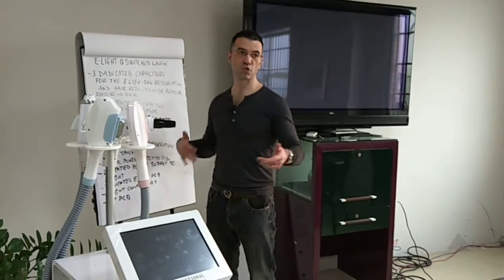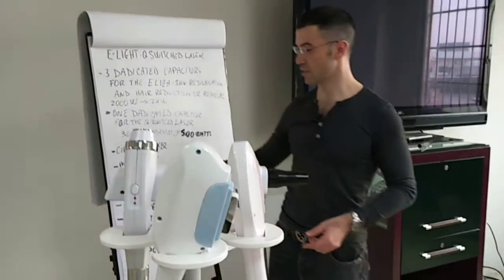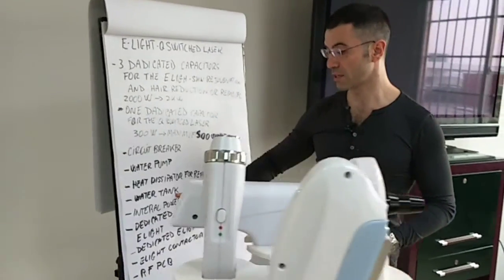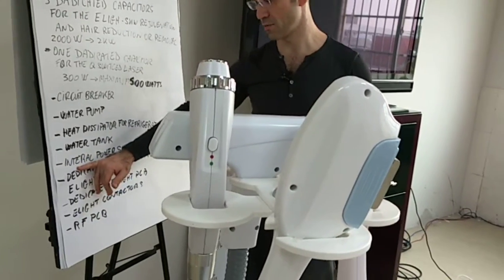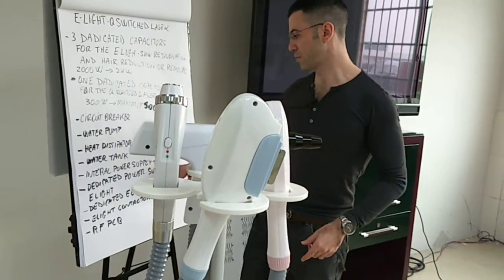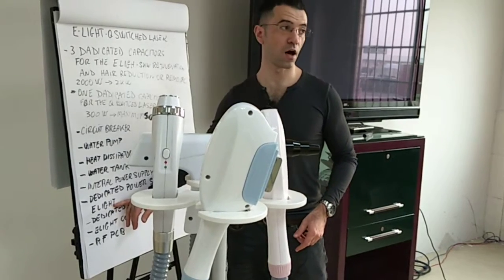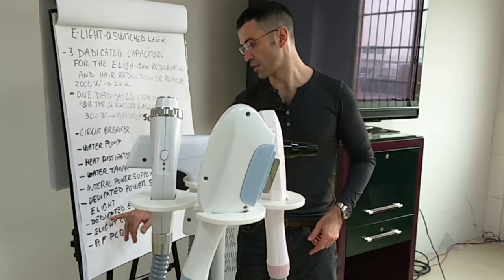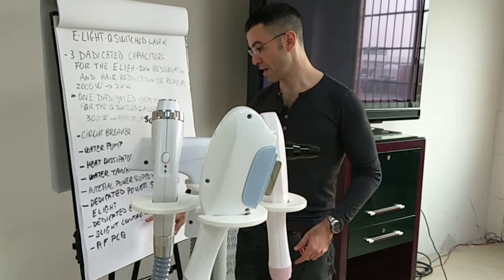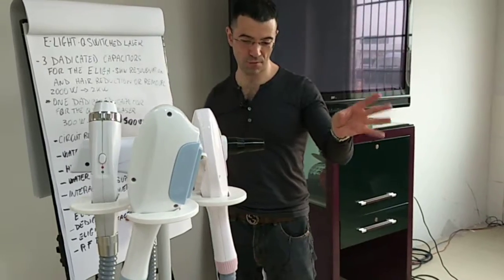A water pump, which is used not only for the 3 light sources, 1, 2, 3, but also for the cooling system. The heat dissipator for the cooling system. Then the water tank, because we need water inside the system for the cooling system and the light sources. An internal power supply to the PCBs, a dedicated power supply to the E-Light, which is quite large. We're talking about 2000 watts. A dedicated E-Light printed circuit board, 2 E-Light contactors.